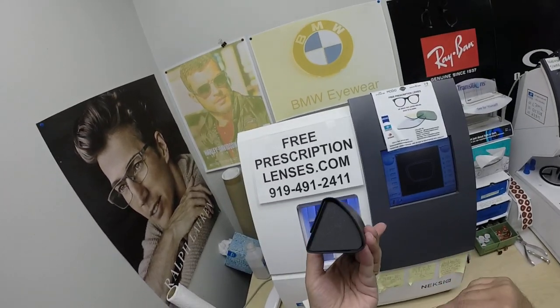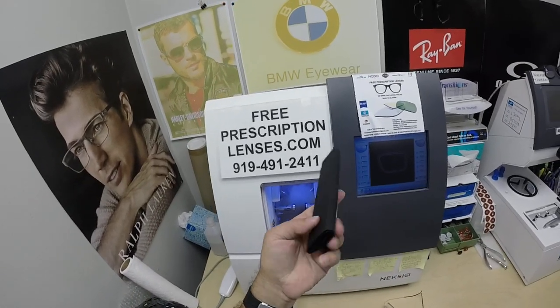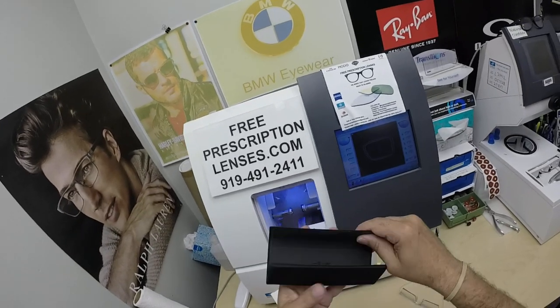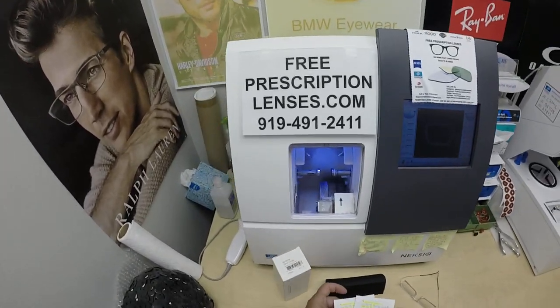And of course you get the Silhouette triangular hard-shell case that actually folds down. So when your glasses aren't there, you can fit it in your pocket, briefcase, coat pocket, however you want to do it. And then when you want to use it, it just unfolds origami style. There's also a Silhouette cleaning cloth, but I left it at my shipping station.